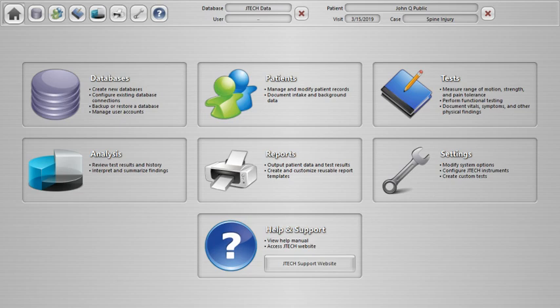I want to talk a little bit briefly about the Northstar software and JTech's production process in general. The tracker software had been updated and made with the feedback of over the 15 years that it's been in service, and we've carried that over along with more into the Northstar framework as well. For those of you who are familiar with some of that previous software, of course, you won't have to relearn a whole lot at all. We've tried to maintain what was good in some of our previous software products and to simply improve upon that where requested and based on, again, that user feedback.